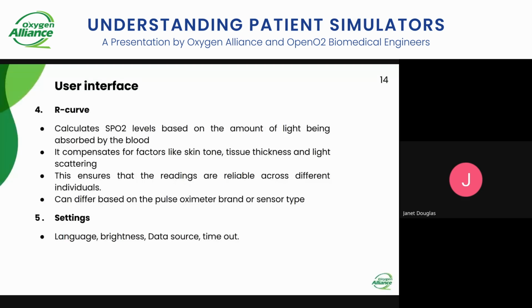All right. So what I would say is, before you do a pressure leak test on a monitor, you will have to do it first without the monitor to identify the rate of leakage that is there. Also, you have to use this leak rate to offset the rate of the full system with the monitor connected to it.